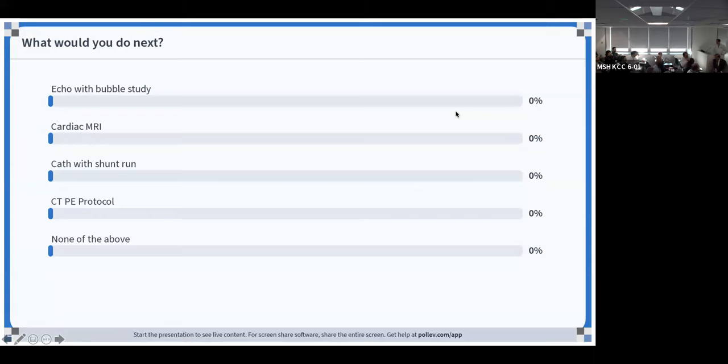The reason I was asking rhetorically, partly, was if it's a PE, the RV should look like garbage if it's dilated, and it doesn't. Right. It looks like good function, but dilated. Right, a PE won't do that, so that was my point, nothing more.